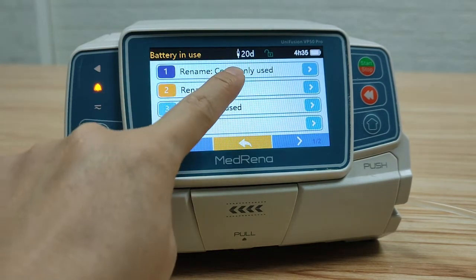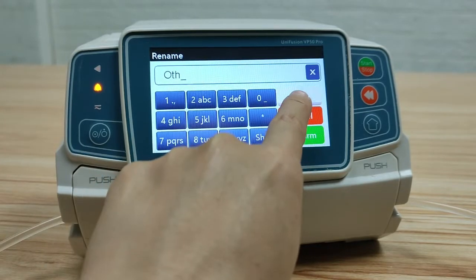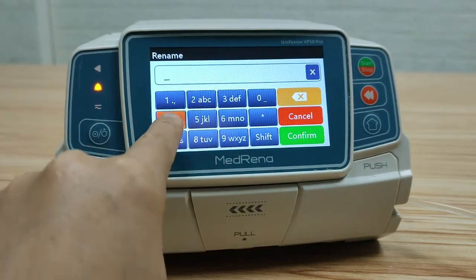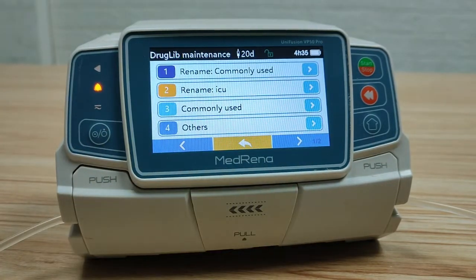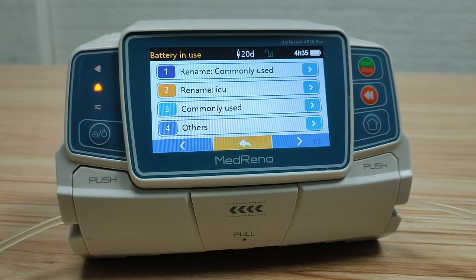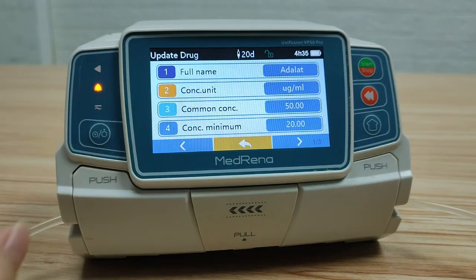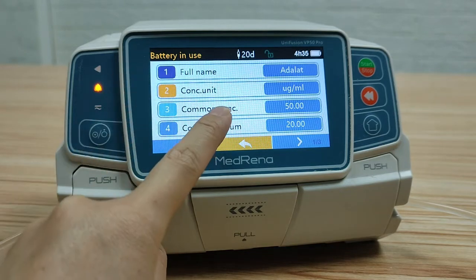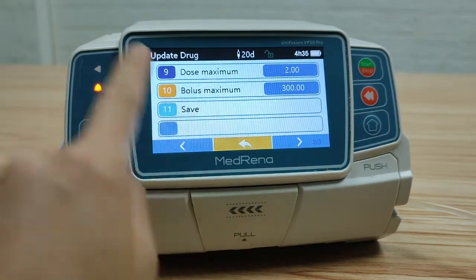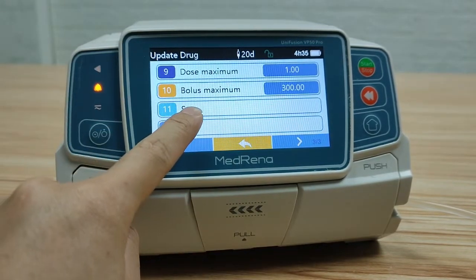Here we can rename the drug group — for example, rename 'drugs' as 'I' and rename 'others' as 'ICU'. Now the drug group name has been changed. To edit individual drugs, select the drug group, then select the drug. Here we can add the drug name, concentration, unit, concentration, and other listed information. Finally, save the entry information.